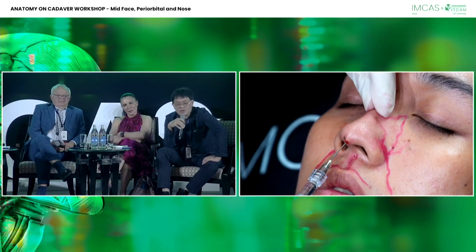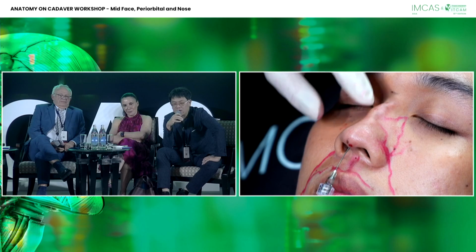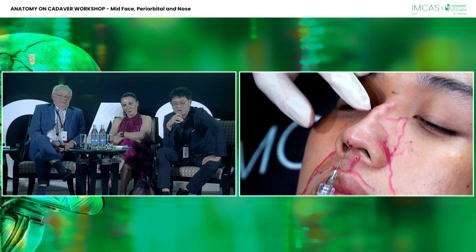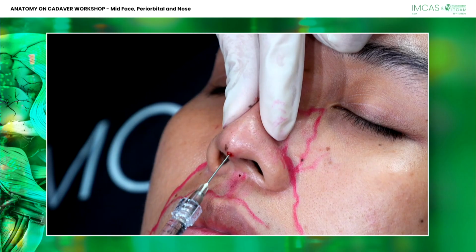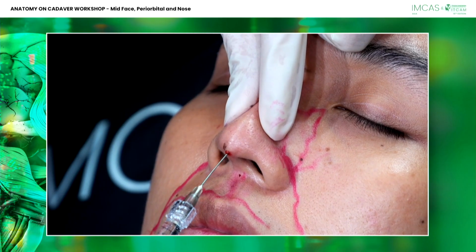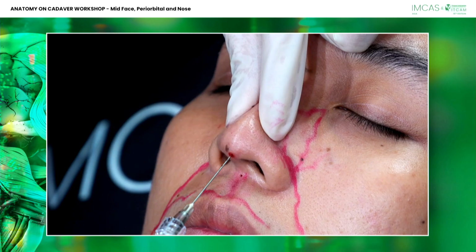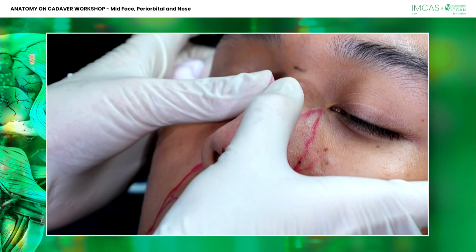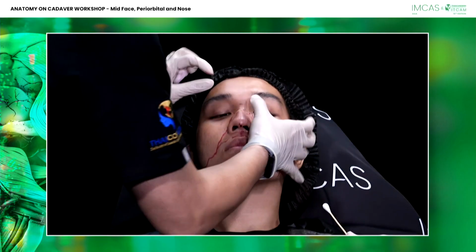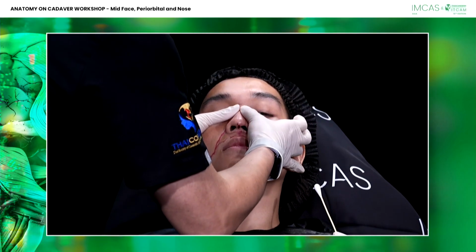So here is the end of the needle at the middle. If you go deeper, you cannot see it here, but from the length is here, and I inject slowly here. And here I provide a special issue, because in Asia a lot of people have nasal allergy, and they do the septal nasoplasty to correct the deviated nasal septum.